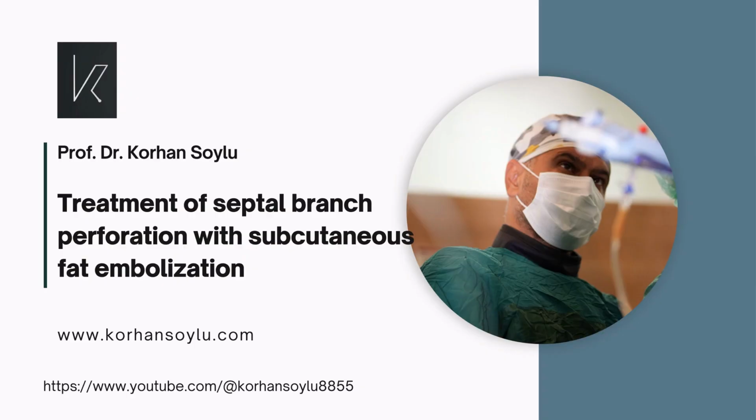Coronary perforation is a life-threatening complication that can occur during CTO procedures. When the perforated artery is a small branch, embolizing agents such as coils can be used. In cases where coil use is not possible, fat embolization can be a backup strategy; using the patient's own tissue and not requiring additional devices may be advantageous.